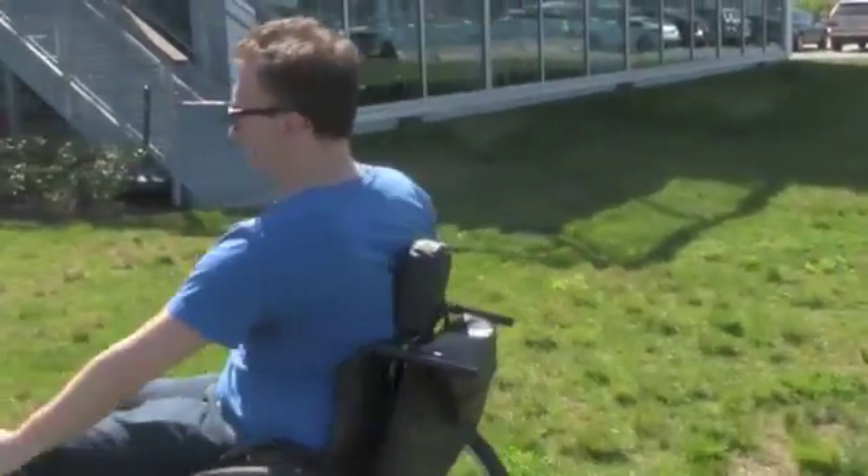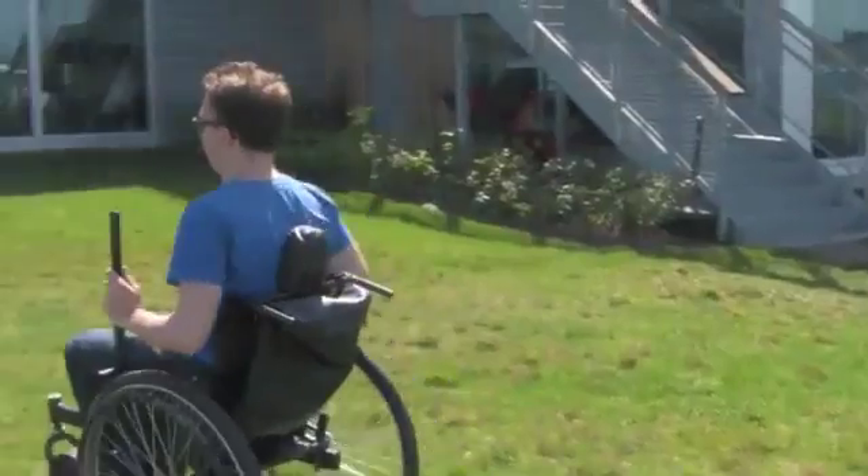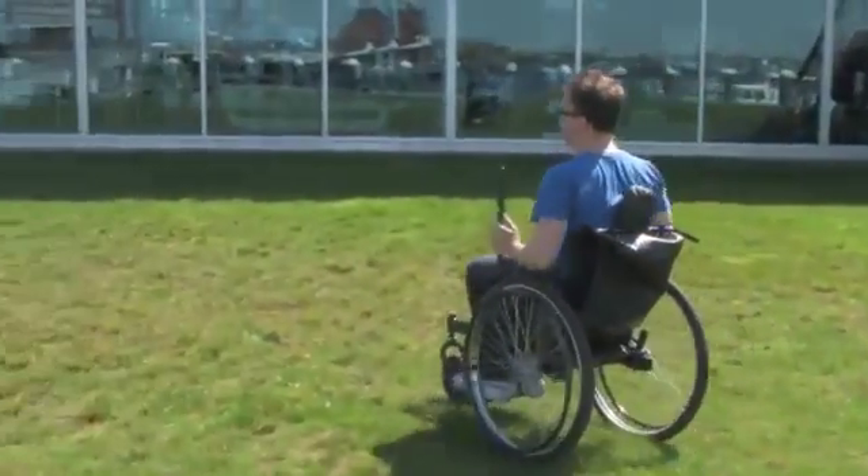To turn, pull back with one arm until the brake engages with the tire, then push forward with the other arm.